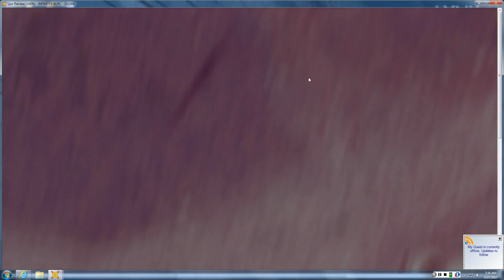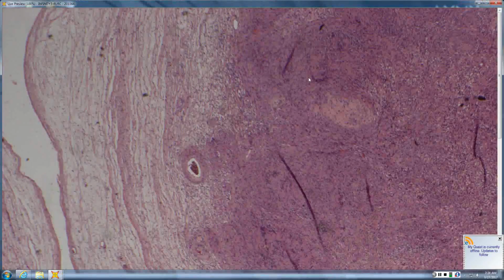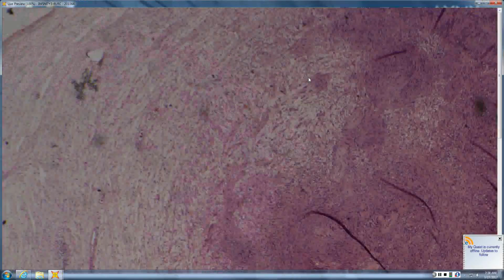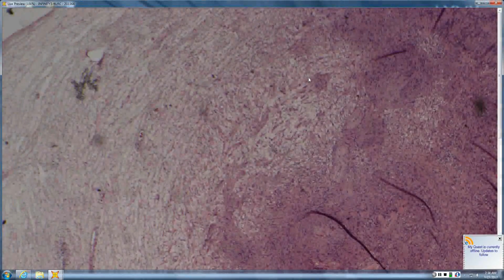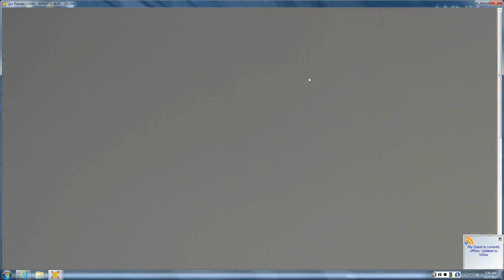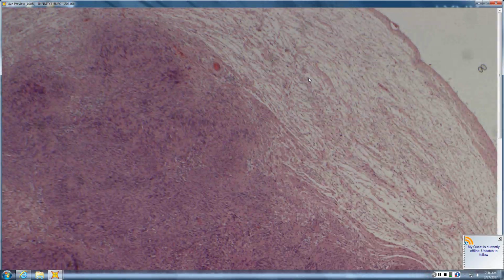And they tend to be strongly S100 positive, whereas if they undergo malignant degeneration, they're patchy and weakly S100 positive. So malignant peripheral nerve sheath tumor has pretty poor expression of S100. If you're thinking MPNST and it is strongly S100 positive, you're looking at a spindled melanoma.